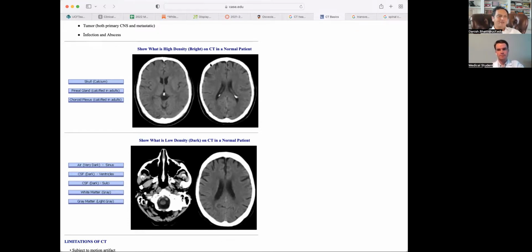Now, if you need to see this information, right now the image is going from -100 to 1000 Hounsfield unit. You say, I want to filter it, so it only goes from +100 to 1000 Hounsfield unit. So there is more detailed definition available here, but then all of this information will be lost. And that is called windowing. So you have a bone window, you have a soft tissue window, you have a CSF window, you have an air window. It's basically various ways to filter to try to see the image differently.